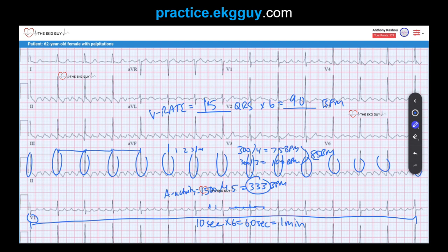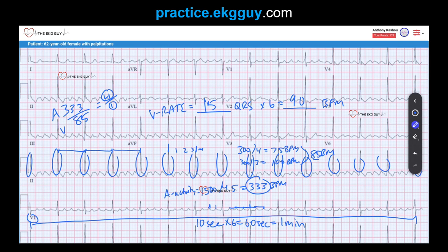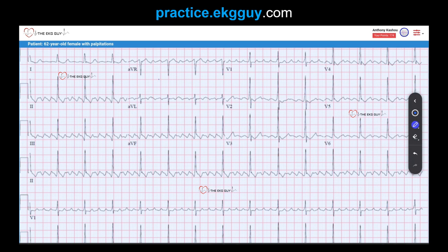If you estimate the atrial-to-ventricular rate ratio — 333 divided by 85 — you get approximately 4 to 1 AV conduction. That means 4 atrial activations for every 1 ventricular activation. This is what we call 4 to 1 AV conduction. Notice also what's called the sawtooth pattern of atrial activity, clearly seen in the inferior leads — this is atrial flutter with 4 to 1 AV conduction.